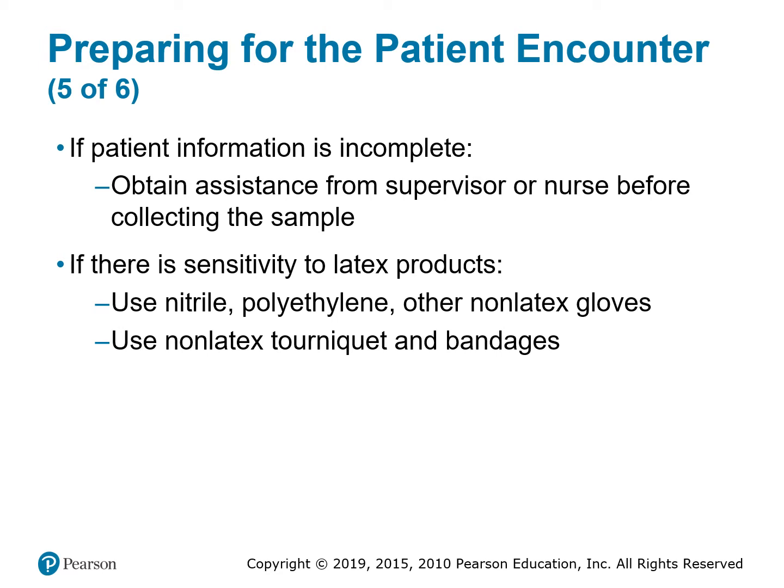So when the nurse comes into the room, just step away from the patient and show her what the requisition says and what his hospital band says. She will either correct what the hospital or the lab has, or say, hey, this is one and the same person. If it's one and the same person, I need you to initial stating that Joe D. Brown and Joseph D. Brown are one and the same person. And again, documentation, documentation, documentation covers you.